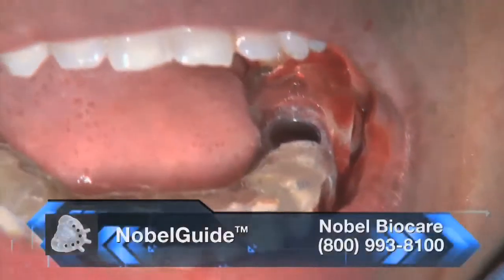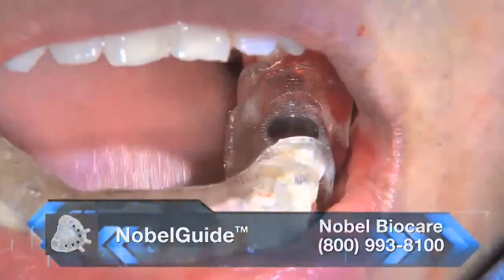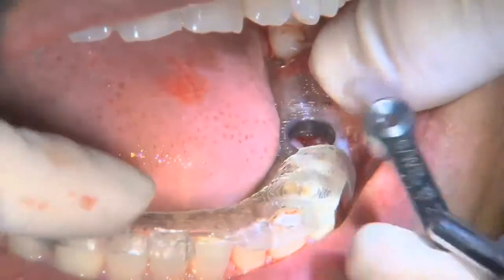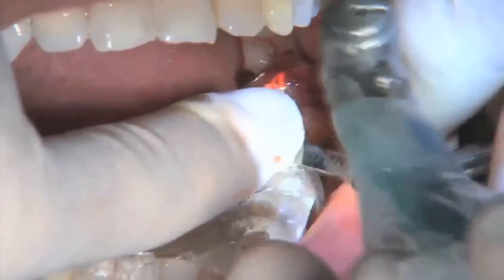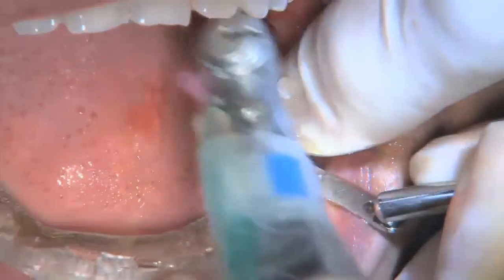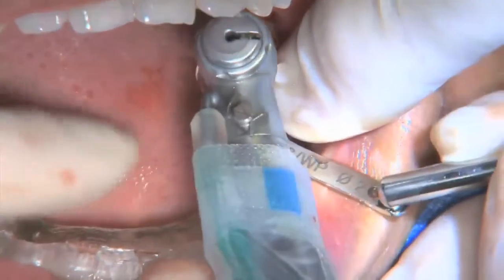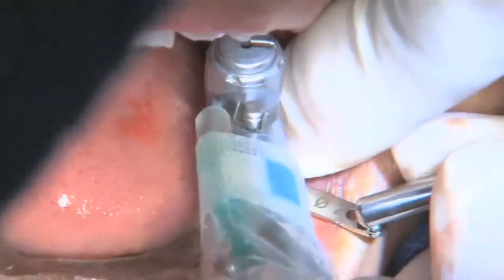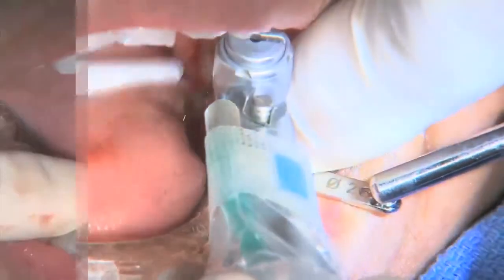Since we already laid a flap, the 2.0 millimeter twist drill was utilized first rather than the start drill. The 2.0 millimeter drill guide seats into the surgical template sleeve. A depth stop was set on the twist drill at 10 millimeters. It should be noted that the guide drills are longer than the standard drills. It's very important that the patient's vertical opening is evaluated at the initial exam.